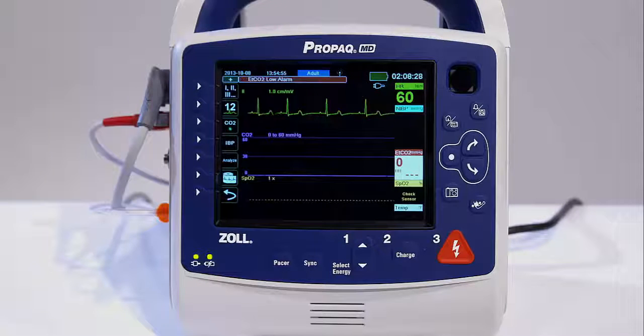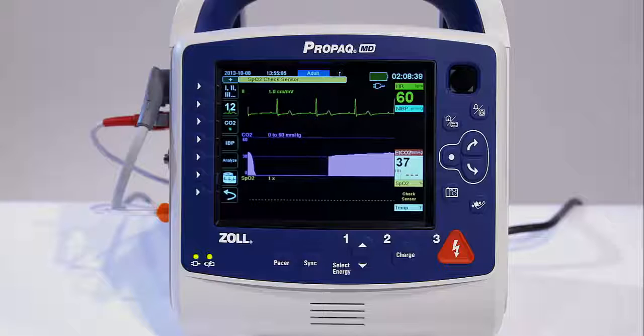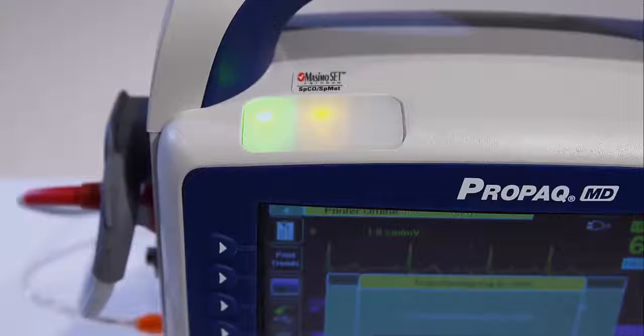Red, yellow, and green lights located on the top of the unit flash on and off when the unit is powered up and are used to indicate a patient alert, equipment alert, and data transfer. Flashing red means a high-priority patient alarm. Flashing yellow means a medium-priority technical alert, and continuous yellow, a low-priority technical alert. Green LED shows continuous when transferring data.